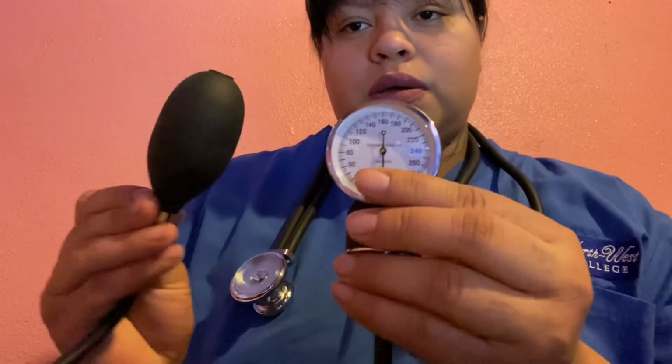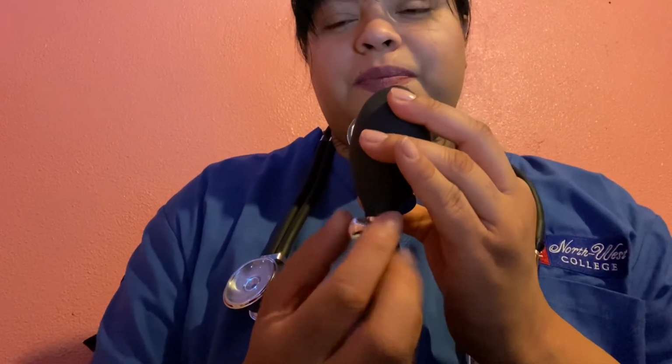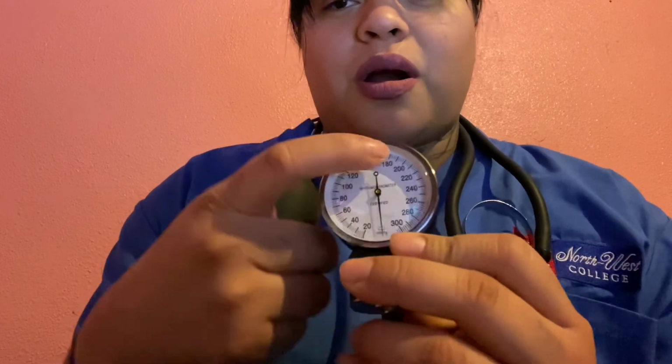And for blood pressure, you want to remember to obtain this along with, what is this? I forgot what this is called, but you want to pump it up to 160. That way the heart contracts. That is the first number, the systolic. And when the heart is relaxing, that is the last number, which is the diastolic number.